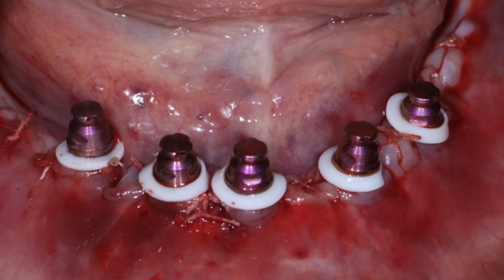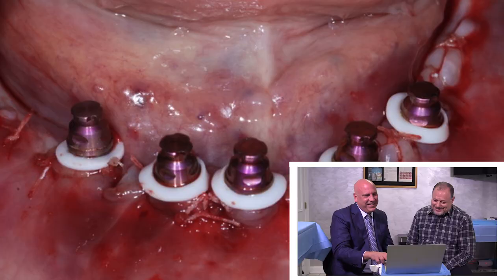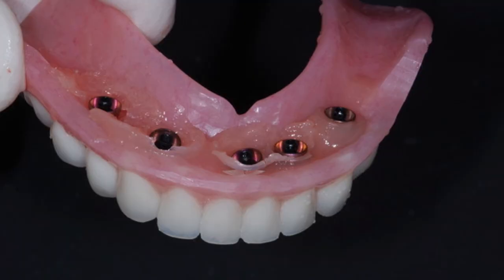It would be better. So now we've got the spacers in that are going to protect not only the suture line, but we don't want to get any of the chair side material underneath the housing that will lock in. So we put the little spacers on, much like you would do with a rubber dam, a similar concept. So the blockout spacers just keep you from that awful feeling. As a dentist, you only have to lock something in once before you go, I need to avoid that. We really don't want to go back and put more sutures in. Exactly. Okay, all right, so now here's the initial pickup.